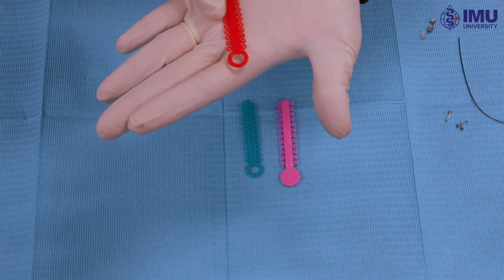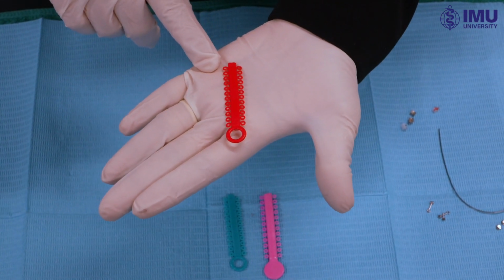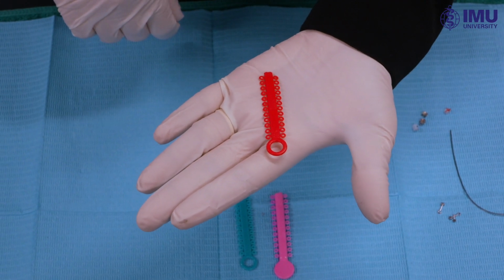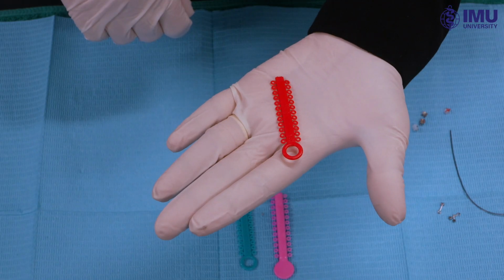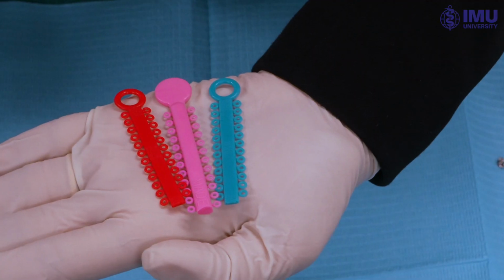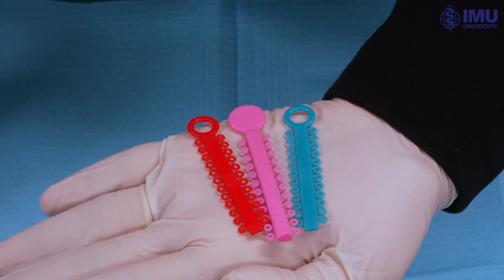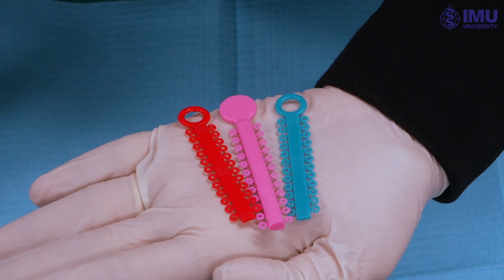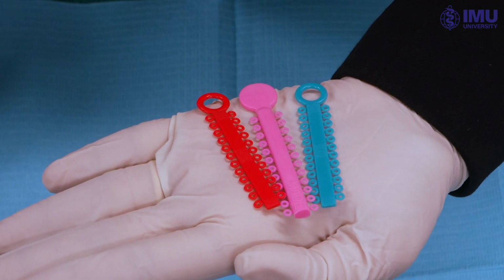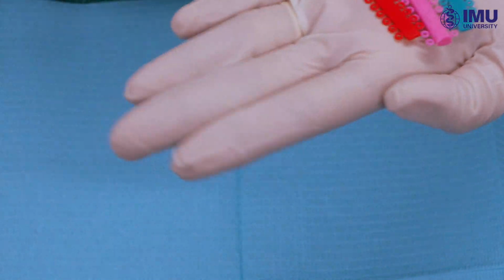Elastic ligature or elastomeric modules are also a passive component of fixed orthodontic appliances used to secure the arch wire in the edgewise or pre-adjusted edgewise brackets. They can be easily engaged under the bracket wings. Depending upon the site and the purpose of placement of elastomeric module, it could be used as an active component in fixed orthodontic appliance therapy. For example, elastomeric module can be used as an active lace back in closure of extraction spaces.